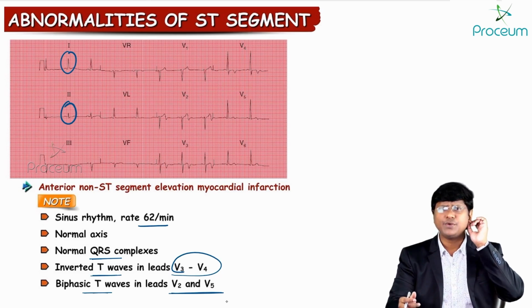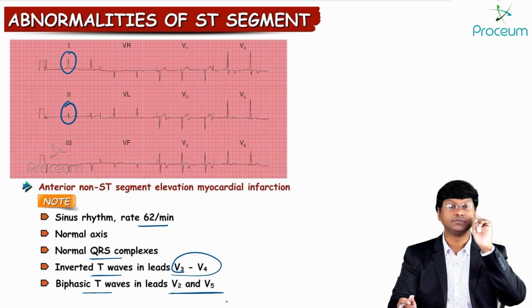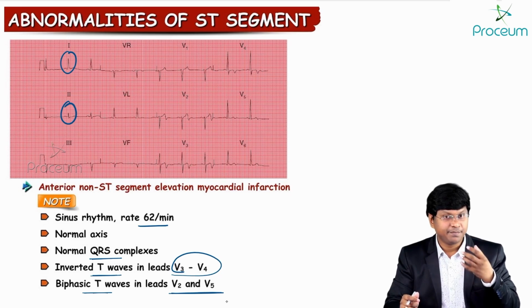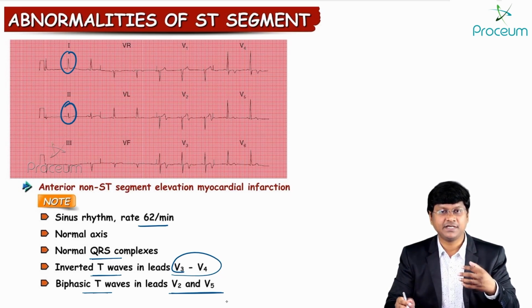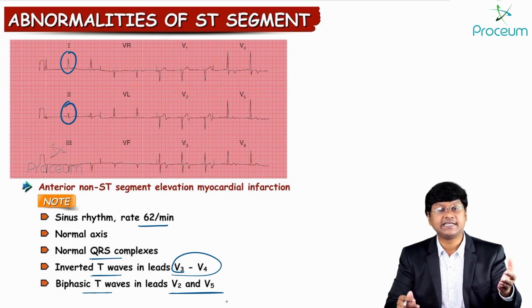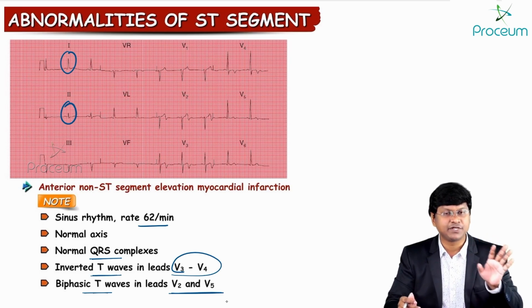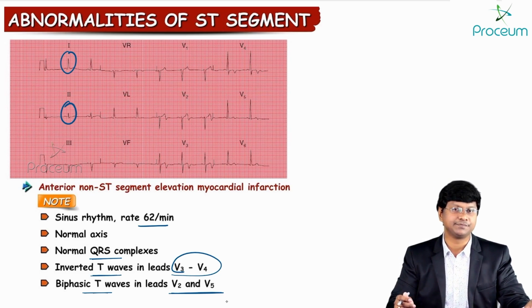Now why do you have this left ear pain in this patient? Let me tell you, many of the patients with MI we have seen presenting to the ENT department, presenting to the dental department. They have gone with the history of pain within the tooth. There is toothache. Oral cavity examination was absolutely normal by the dentist. ECG was done, and the ECG was showing ST segment elevation.